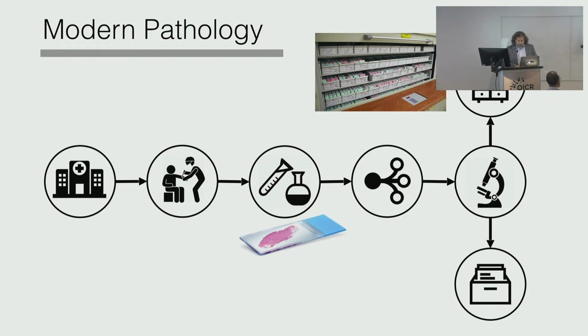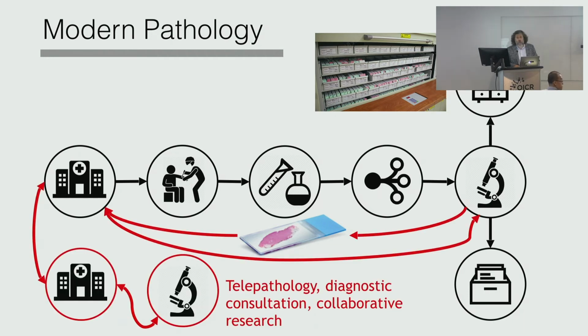And it gets really complicated. I will show you an image that shows the actual complexity. It gets complicated if pathologists are working on rare cases. Suddenly you have to add an additional layer of complexity: if I don't know what is on the glass slide, I have to send it back to the hospital. The hospital sends it to another hospital. Another hospital sends it to another pathologist.